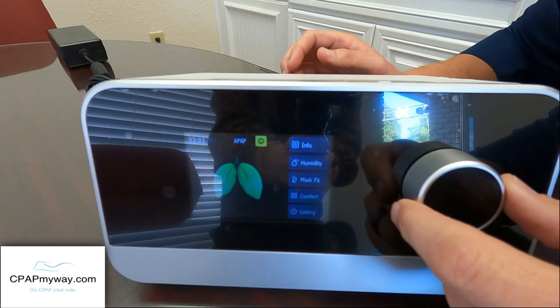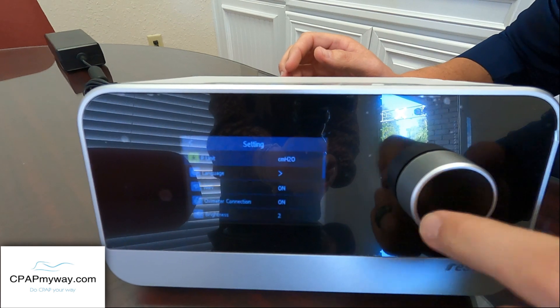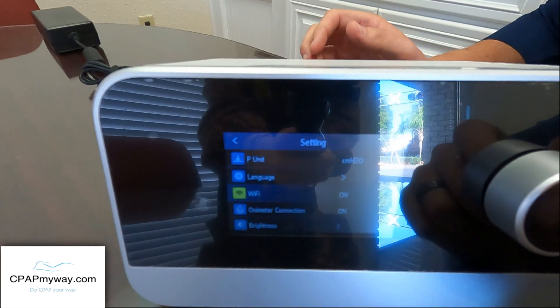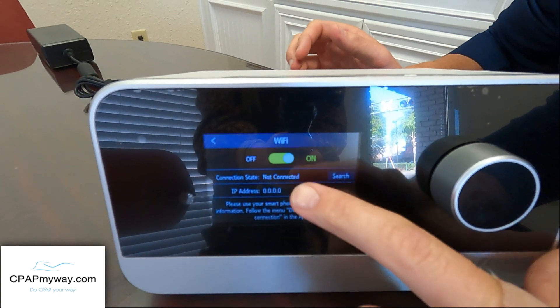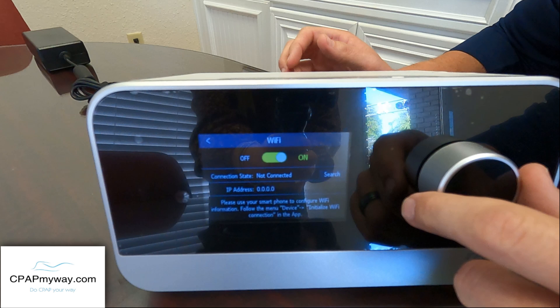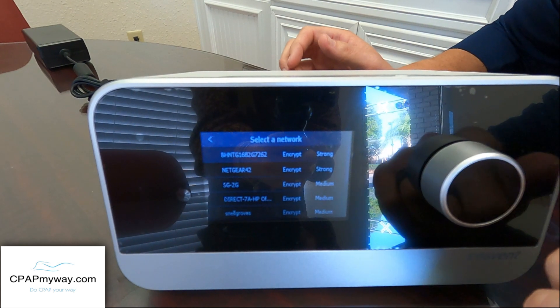So what you want to do is scroll down here to Settings. And once you get into the Settings, you should see a Wi-Fi selection. First off, you want to make sure that's on. But if you're receiving this for the first time, it's probably not connected, so you want to hit Search.